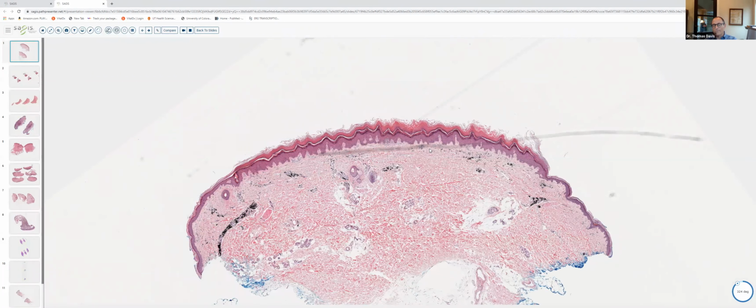And this, of course, is a tattoo. And of course, tattoos can be either cosmetic or they can be iatrogenic. You know, sometimes the skin is tattooed at the site of a radiation port, or they can be accidental or industrial. But in any of those instances, the lesion forms because there's been mechanical introduction of an insoluble pigment into the dermis.